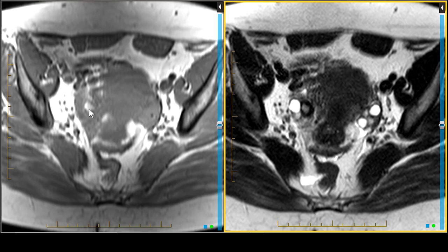This mass or cyst is bright on T2 and bright on T1, therefore it's a hemorrhagic cyst. One way to prove that would be to do fat suppression — if it completely suppressed out you might consider a small dermoid. It didn't suppress, so it's a hemorrhagic cyst. These types of cysts give rise to hemorrhagic fluid collections. So you're going to use the T1 weighted image for anatomic purposes, including looking at the bone marrow, and also to characterize abnormalities as being fatty, proteinaceous, or simple fluid-like in their nature.